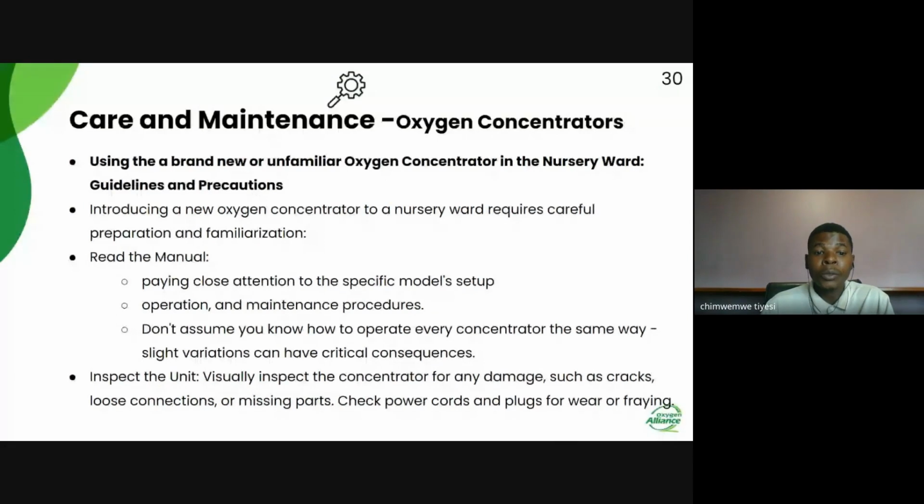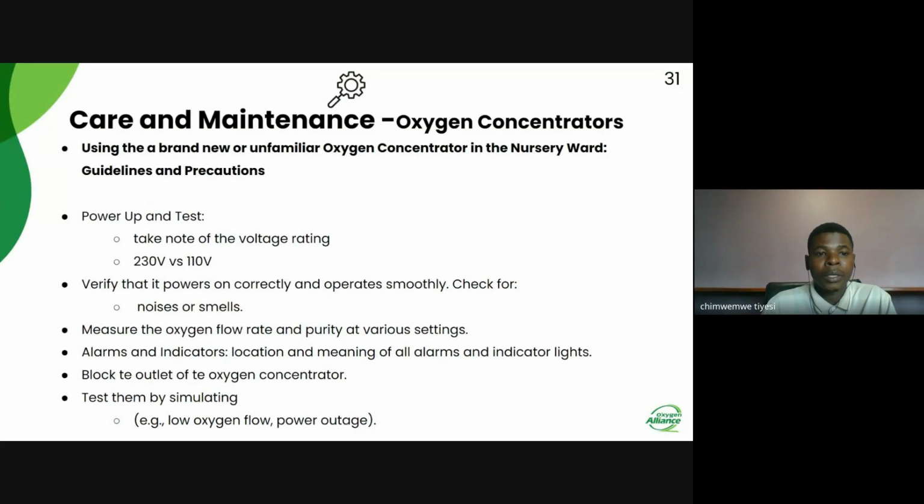Of course, you need to read the manual and pay close attention to the specific model setup, operation, and also maintenance procedures. Next, we are continuing with the brand new and also unfamiliar oxygen concentrators. So for the power up test, what you need to do is to check the voltage rating on the oxygen concentrator.